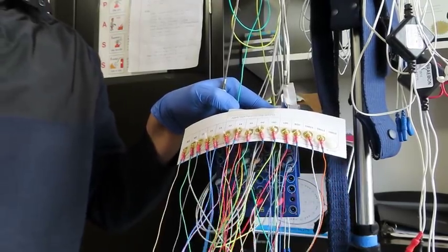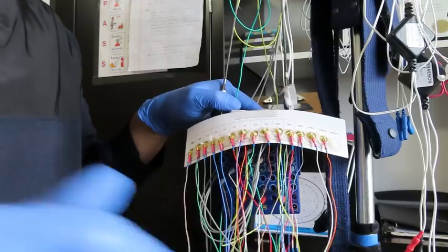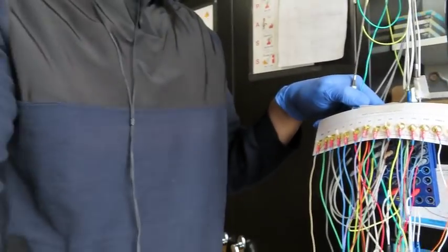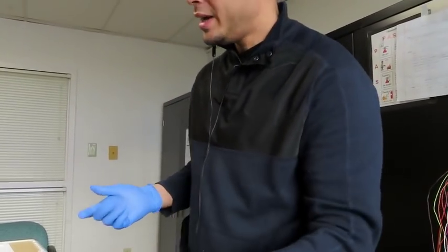So a patient comes in, how you doing, how's everything, get their history, see what's going on with their sleep, why are they coming in for the sleep study. Definitely good to have nowadays, just because there's so much more severe patients. So the more you have this done, the better off both you and the patient are going to be for the night. So it's good to pre-set up.